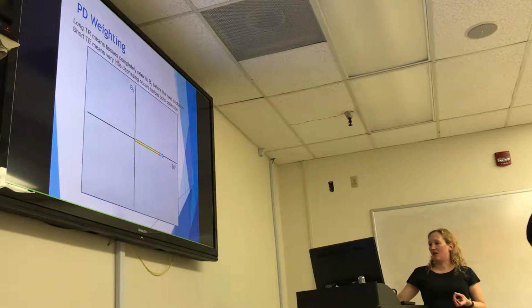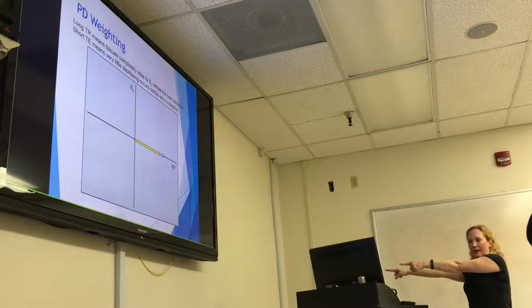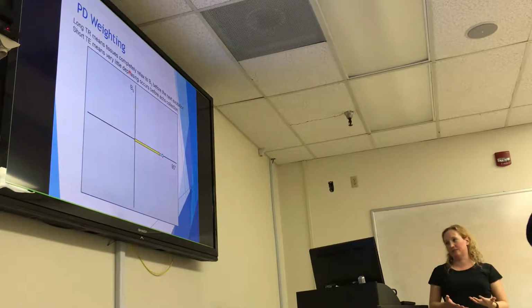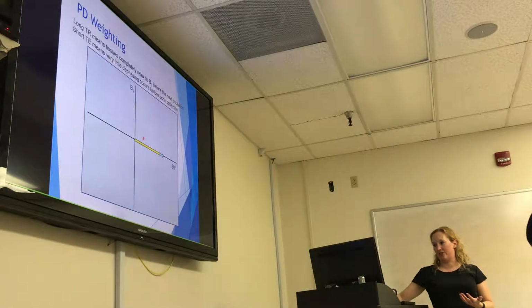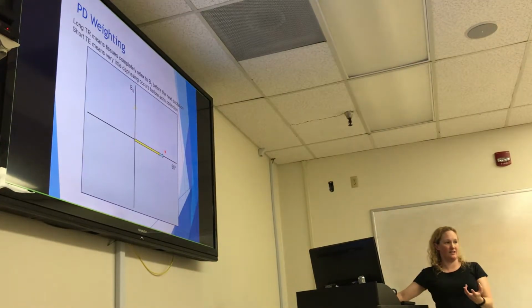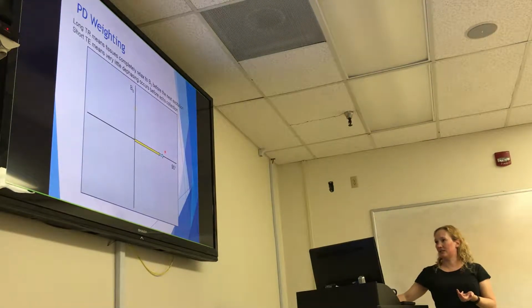So our long TR means that our tissues go all the way back down, and our short TE means that we don't have a lot of dephasing. And so we have this situation where we're kind of getting signal from both types of tissue, fat and water, but it's based on the density of the protons, as opposed to T1 or T2. All right, so let's look at an image here.